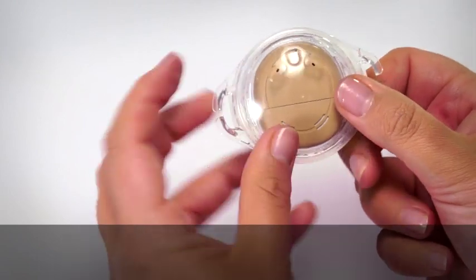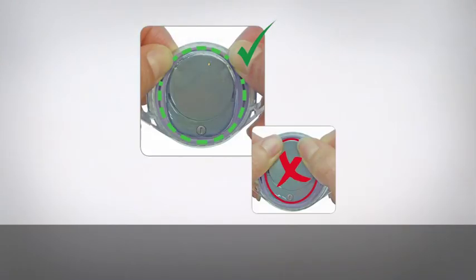Turn the Aqua Plus over and firmly press around the edges until the base is flush with the top cover. Make sure you don't trap too much air in the top cover. This may affect sound quality and comfort.